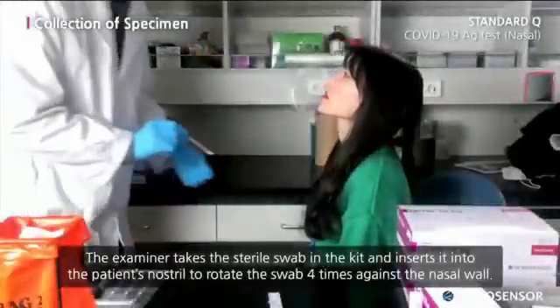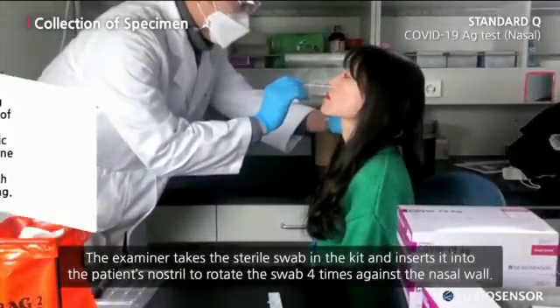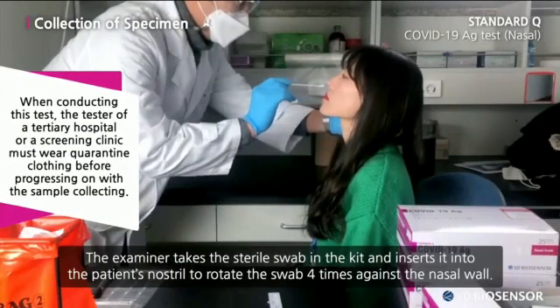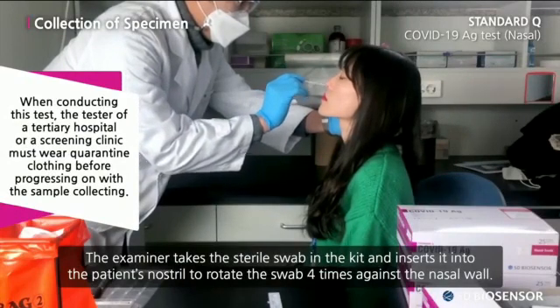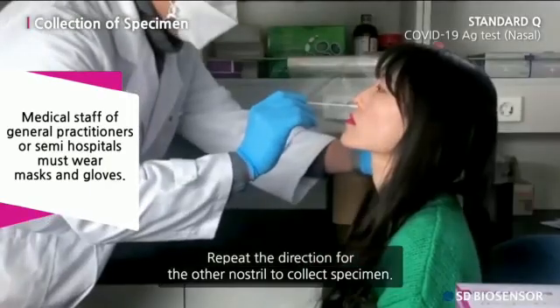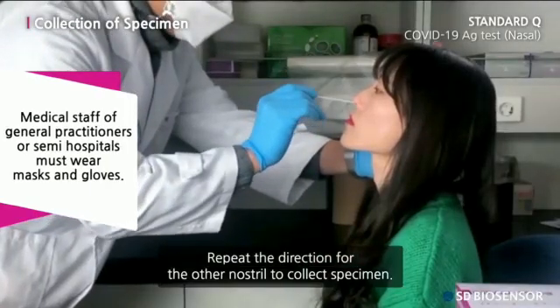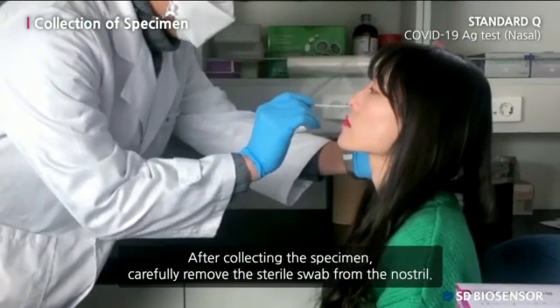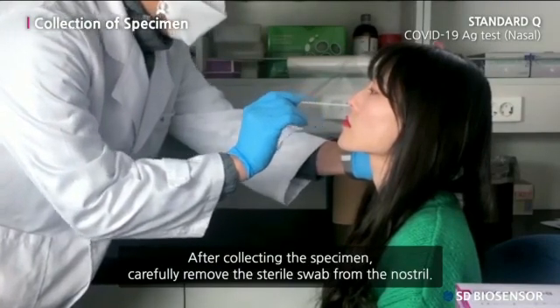The examiner takes the sterile swab in the kit and inserts it into the patient's nostril to rotate the swab four times against the nasal wall. Repeat the direction for the other nostril to collect the specimen. After collecting the specimen, carefully remove the sterile swab from the nostril.